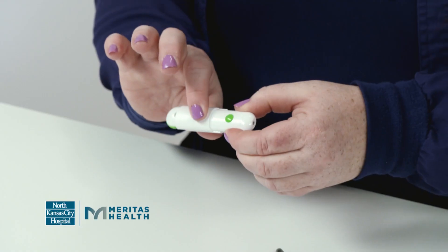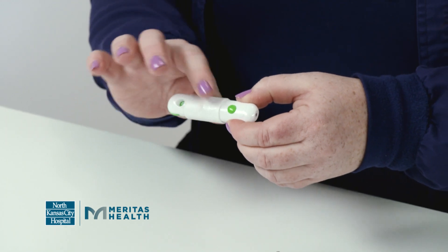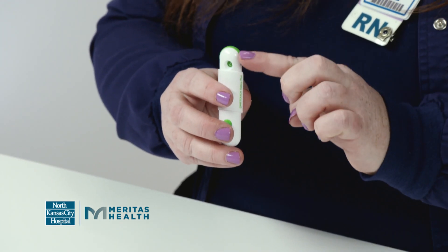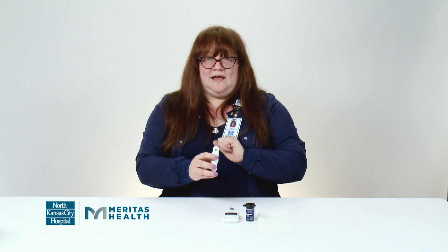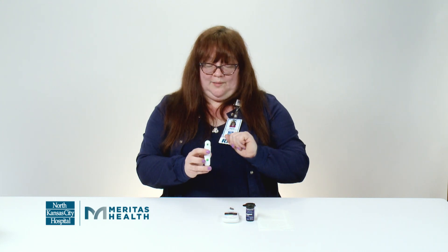The middle portion of the lancet device moves back and forth to set that lancet — you want to make sure you set it. There's a knob at the bottom of the lancet device that adjusts how far the lancet goes into your finger. If you're having a lot of pain when you poke your finger, you want to turn that number down. If you're not getting any blood, you want to turn the number up.